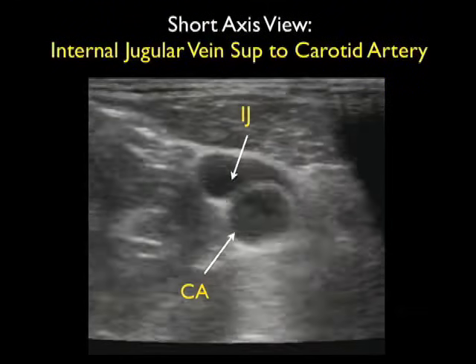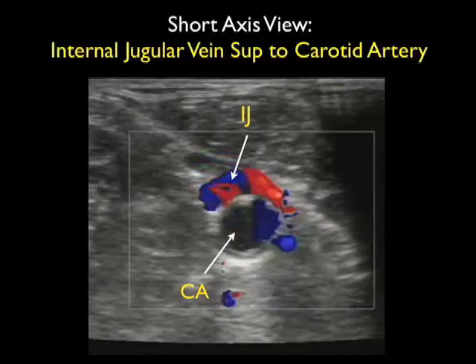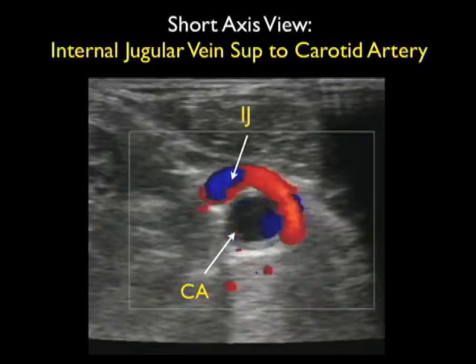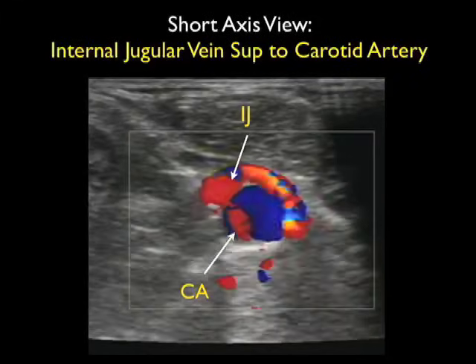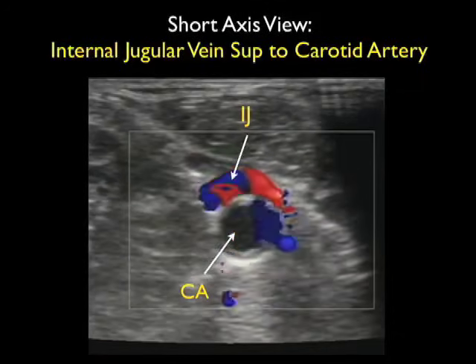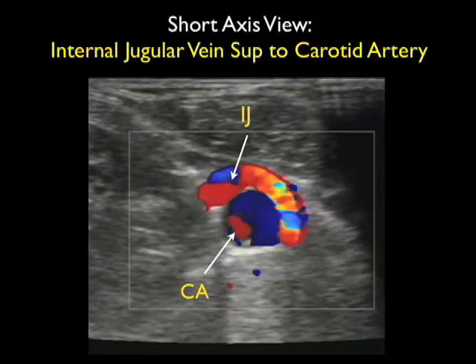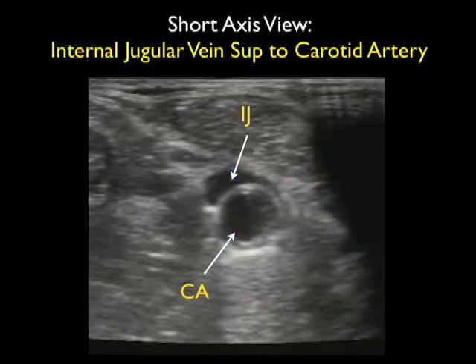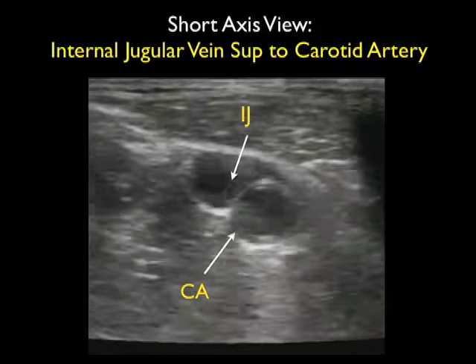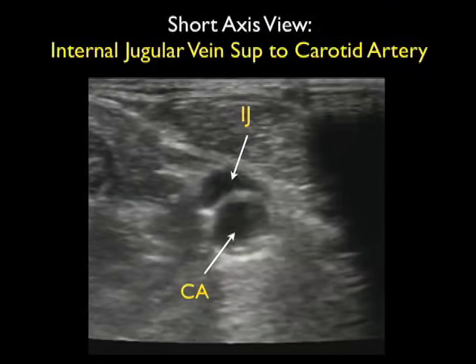Notice here we'll place Doppler flow to confirm the carotid artery, shown here deeper to the more superficial internal jugular vein. In this patient it would be extremely difficult to cannulate the internal jugular vein without puncturing the carotid artery. Best to attempt cannulation in another area of the body.